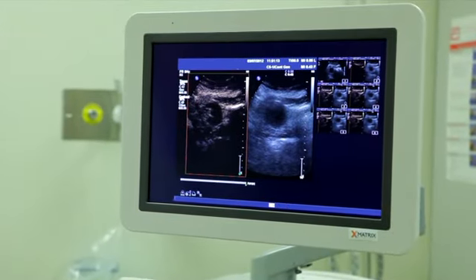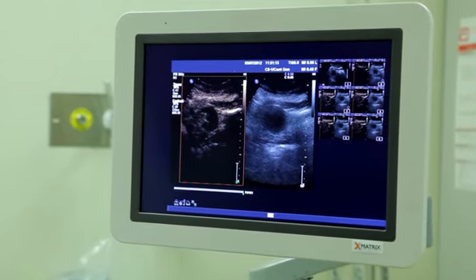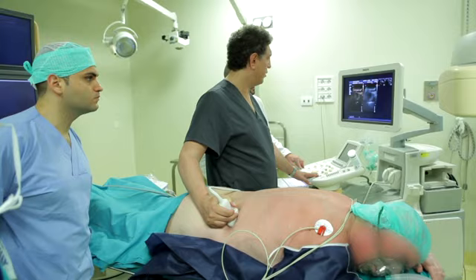We performed a percutaneous biopsy, and it was a clear renal cell carcinoma, G2, and so we decided to treat it with microwave ablation of these lesions. Well, as you can see in this CT, we can see the lesion very well. It is 4 centimeters by 3.8, and it is localized at the lower lobe of the right kidney.